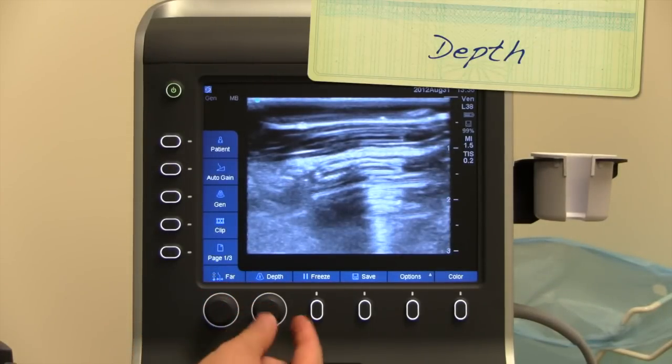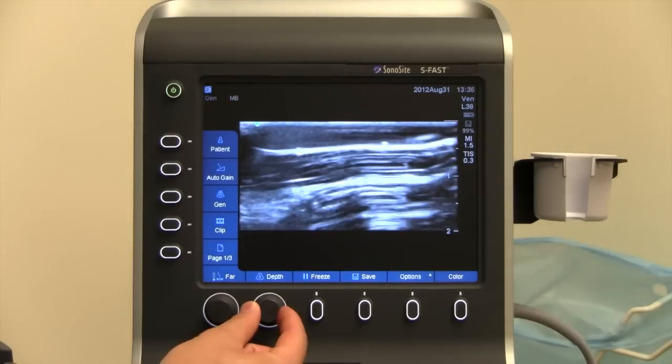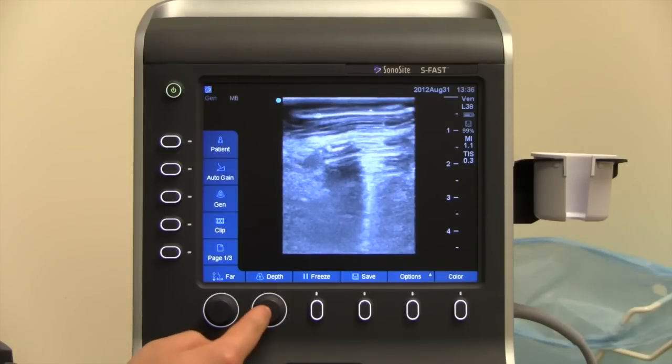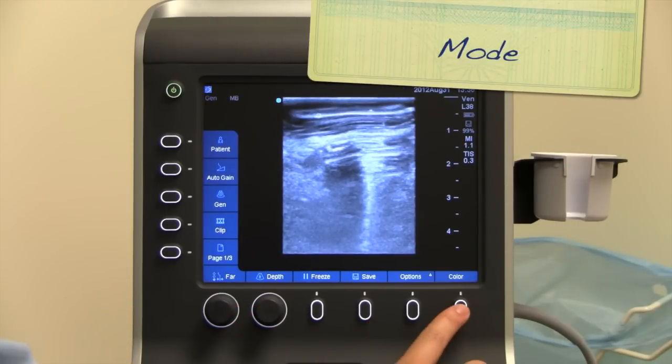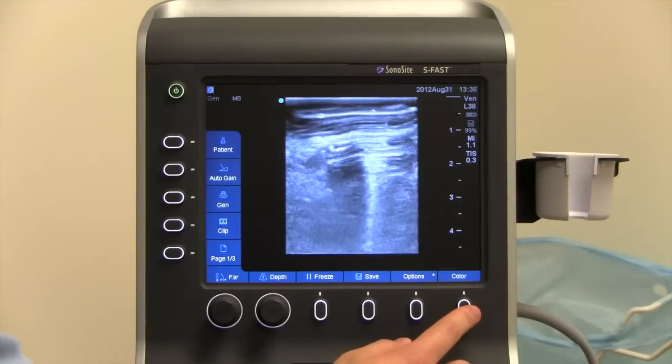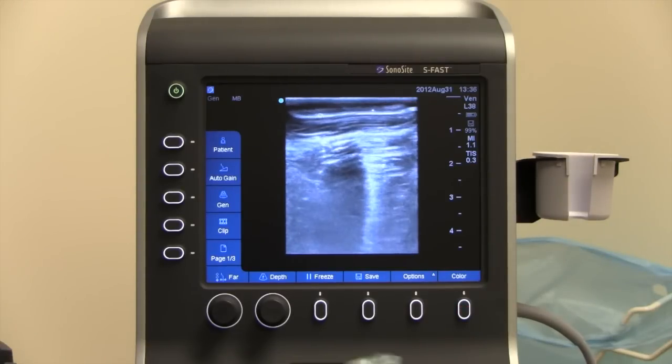The depth button is right next to it — this knob right here — and this will increase or decrease your depth by turning it. The last thing is to choose the mode between color and 2D — you can push this button over here, all the way on the far right-hand corner. And that concludes our presentation for the S-Fast.